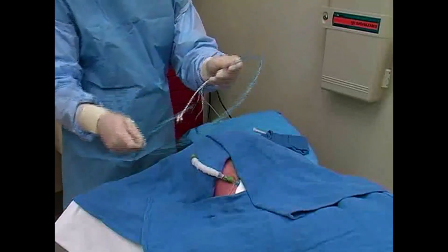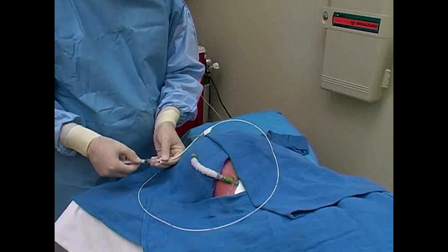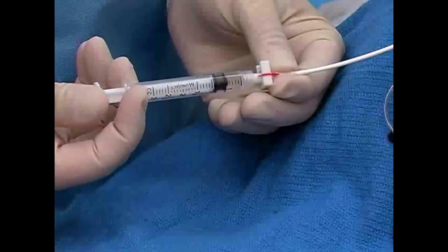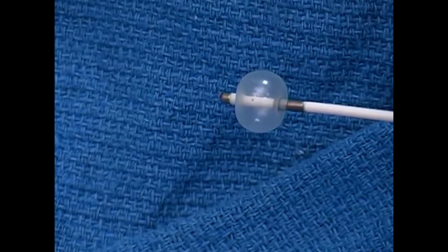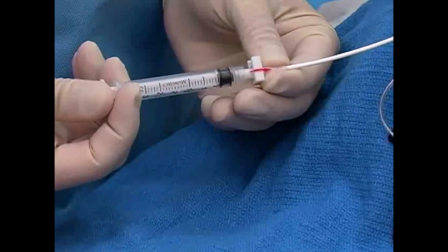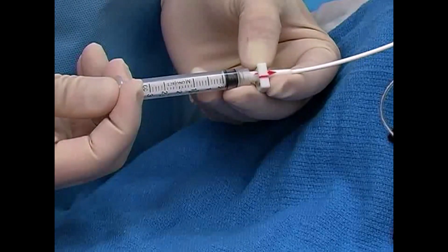Bring the pacing catheter to the sterile field. Test the balloon on the catheter by inflating it with the recommended amount of air, which is usually 1.3 to 1.5 milliliters. Note that the inflation port has a sliding gate valve that is used to keep the balloon inflated.